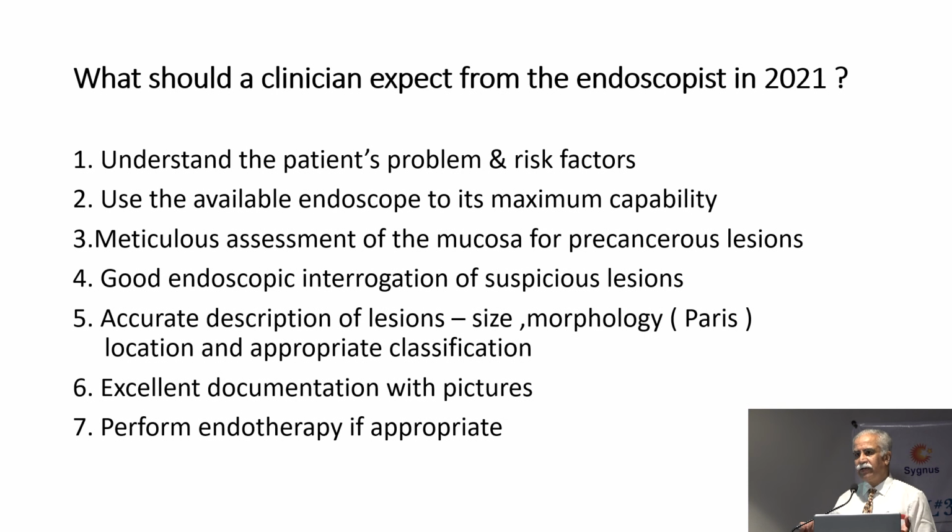Then even if you are given an expensive toy, you're not going to pick it up. Then you can use chromoendoscopy. You may need non-magnifying scopes to look at those polyps. You can use, as I showed you, acetic chromoendoscopy for the Barrett's. So you can use dye chromoendoscopy, even with white light endoscopy, to pick up lesions. So remember, whatever tool you have, exploit it to its maximum advantage.